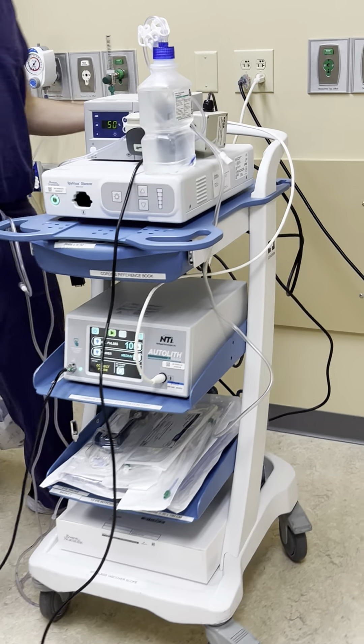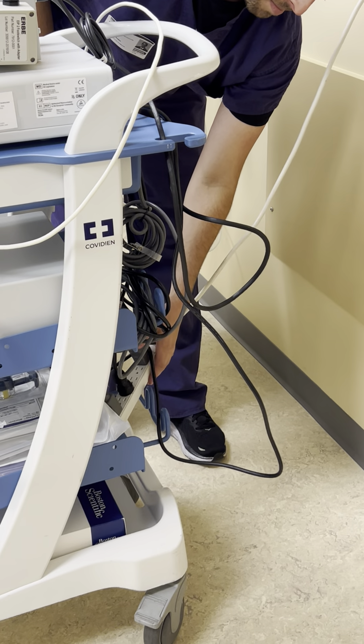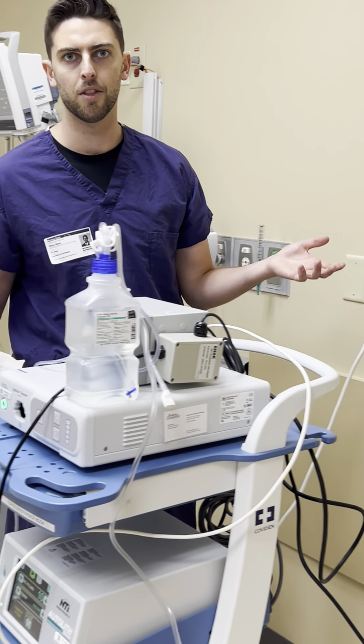What we're going to do next is make sure we plug everything in. It is all connected to a power strip in the back, so you can plug that power strip directly in or into an extension cable depending on the room setup.